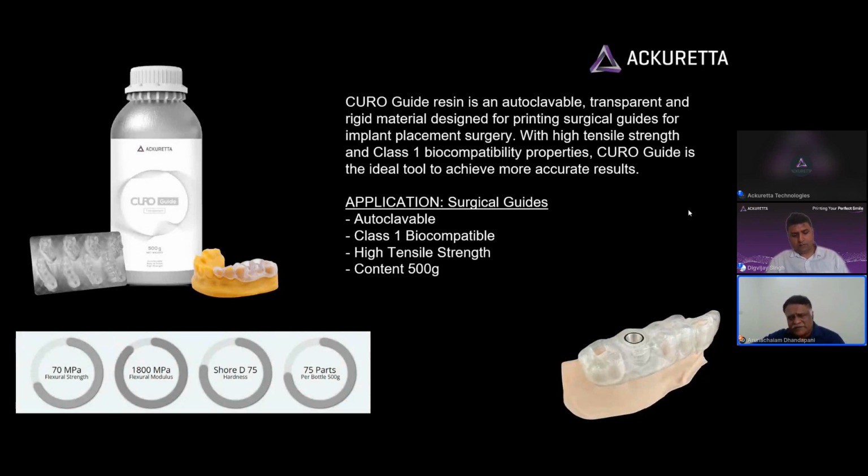Now, one of the problems of guided surgery, I won't say a problem, is that if you suddenly decide to change your plan and choose an alternative pathway, for example, if you're going through a planned flapless procedure and you want to suddenly change to a flap procedure, if your design of the guide supports that flap procedure, then it's a different story. You can still work with it.